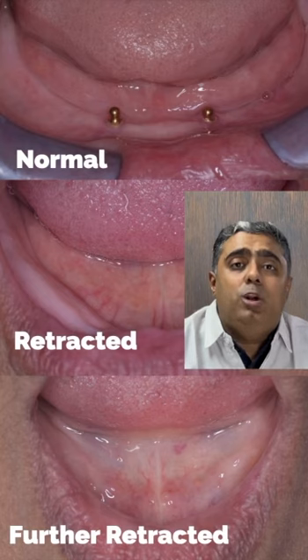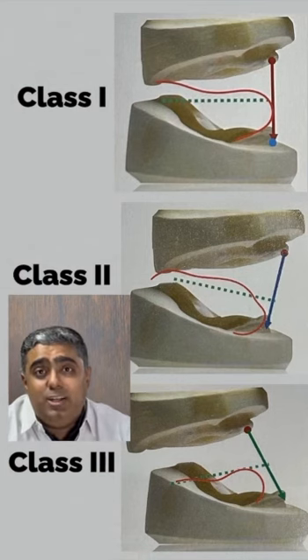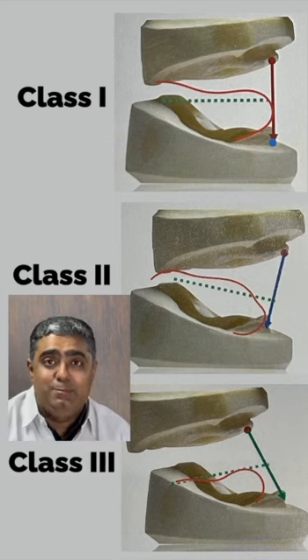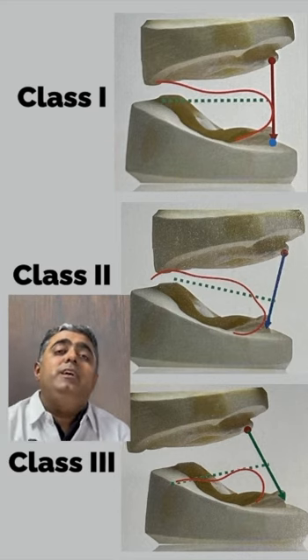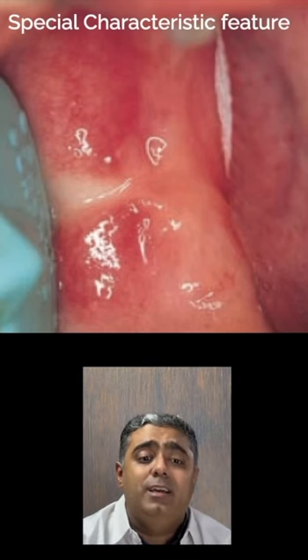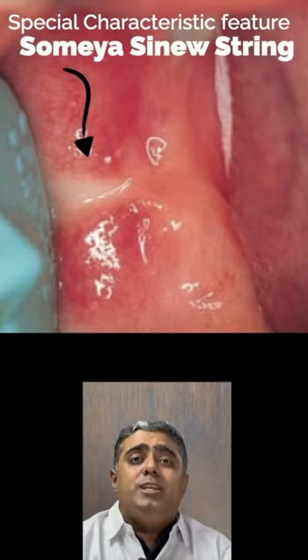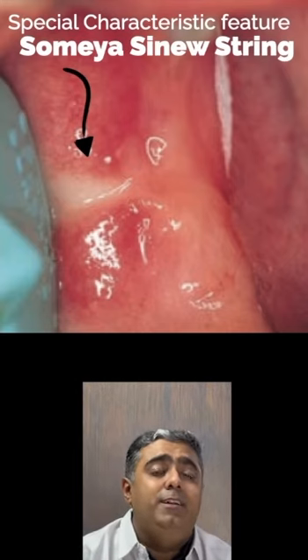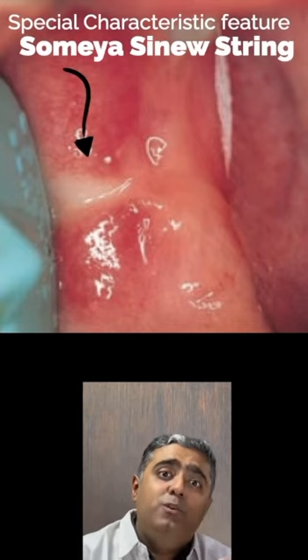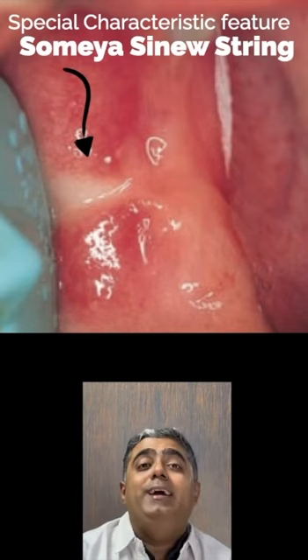Next is the skeletal relationship of the upper and lower arch, whereby Class I is a favorable scenario for SEMCD and Class III is a relatively less favorable scenario. Also, a special characteristic called the Somaya sinew string is taken into consideration, which is nothing but the insertion of the buccinator into the base of the retromolar pad. This acts as an accessory that should be relieved in the lower denture to achieve better suction.